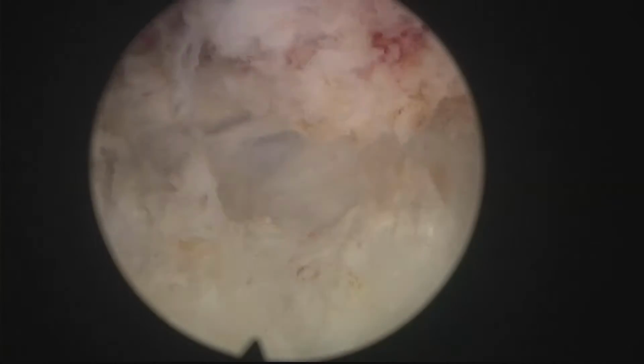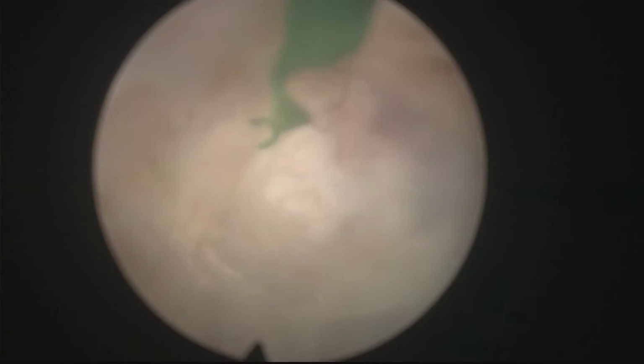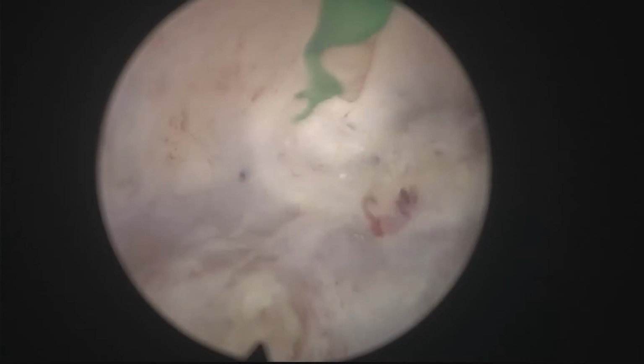So this is one of the advantages of pulse modulation, I think, that the enhanced cutting properties of this laser help in the dissection of these planes. So here I was carefully judging what is the proper plane. I couldn't find a beautiful plane as we would normally find, and this is probably due as well to the previous TURP.